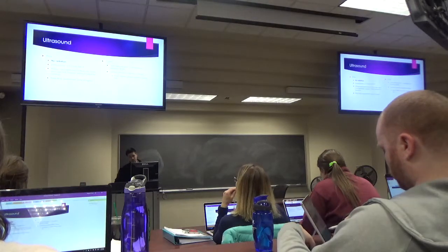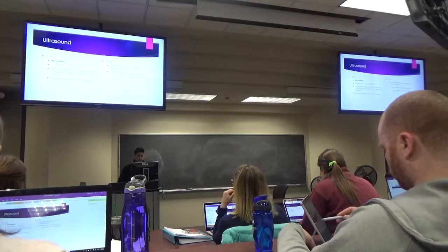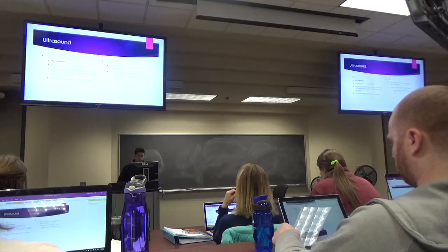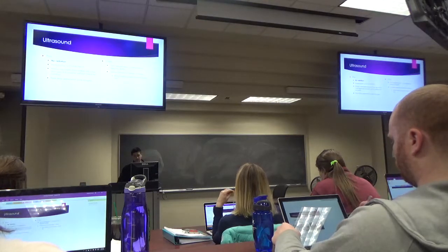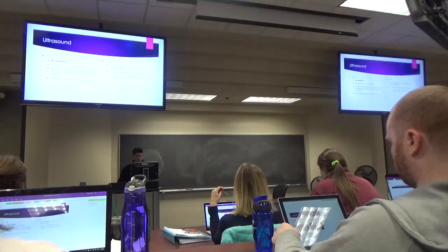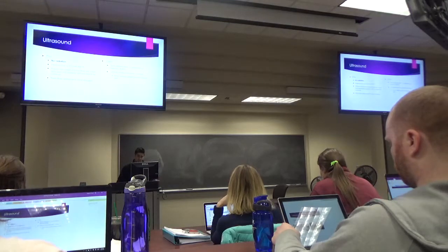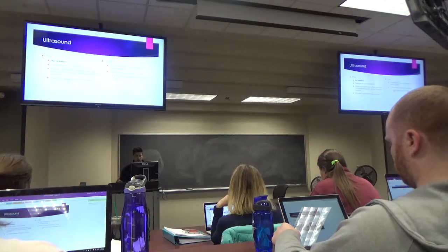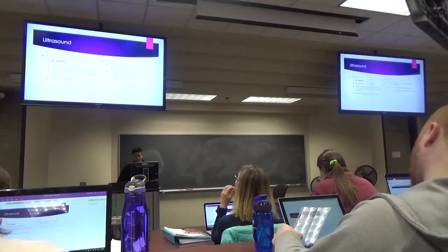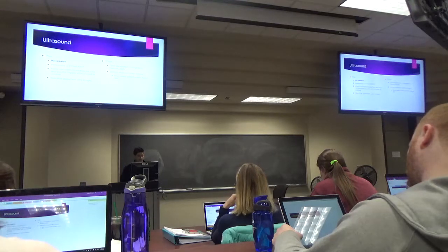The cons of this, though, is it's very, very tech dependent. So it depends on the competency and reproducibility by the tech. Again, some institutes have different protocols for what the tech does, and so it's a little bit hard to get the same reproducibility when you're trying to compare ultrasound to ultrasound. And also we have a limited window of visibility at times because of things like body habitus, if the patient's very large or obese, or if they have a lot of bowel gas because they just ate a meal, that can also limit our window to viewing the abdomen and things of that nature as well.